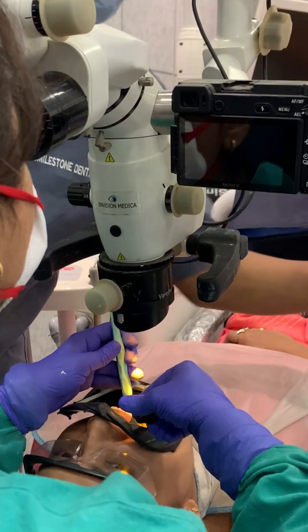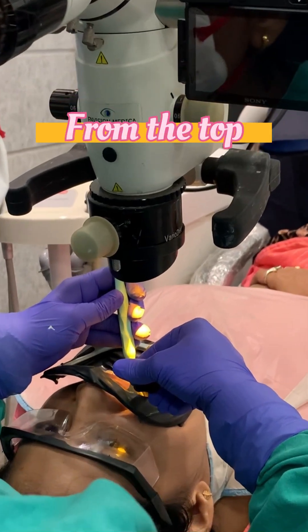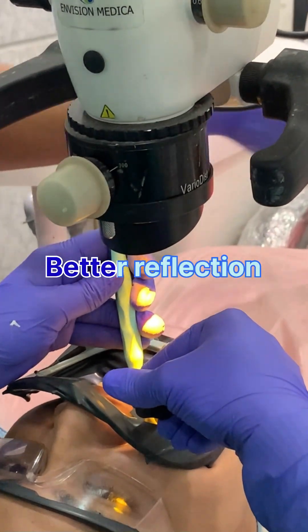If you position the light to hit your mirror from the top, you will get better reflection and obviously a better image.